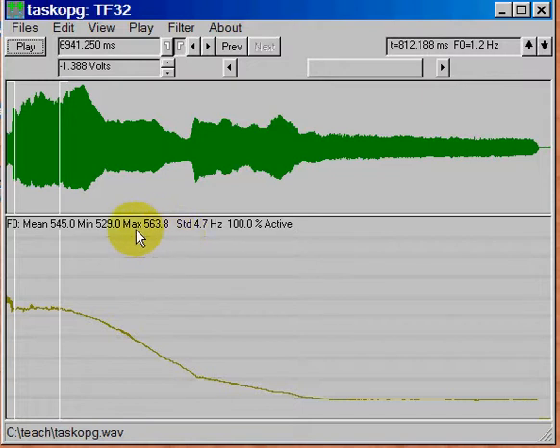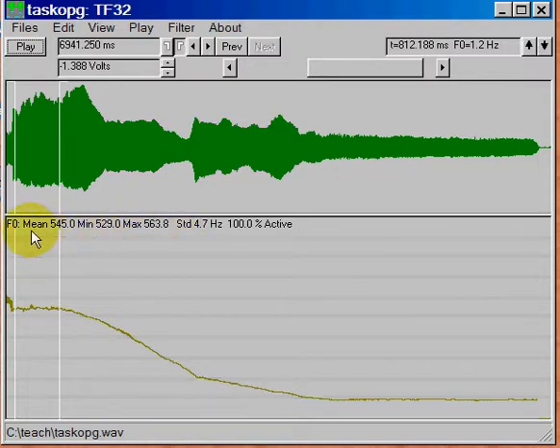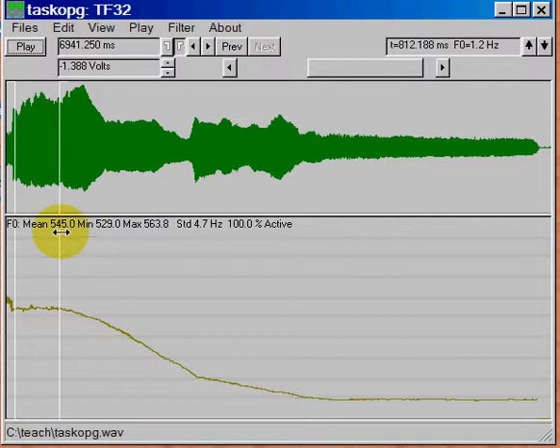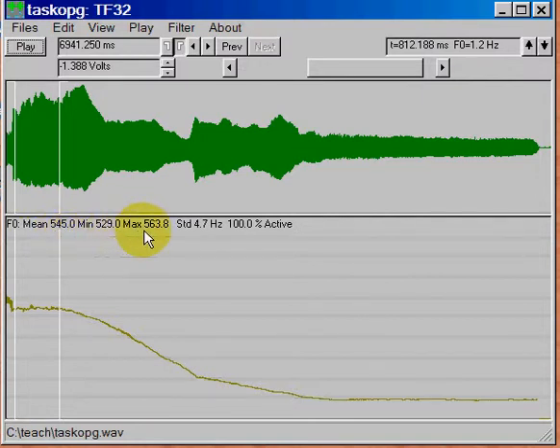And capture that with the window, with the left and right cursor. And then I can look and find, up here you can see there's some numbers. There's the mean fundamental frequency, which is the mean value between the cursors. This is the minimum value and the maximum value.